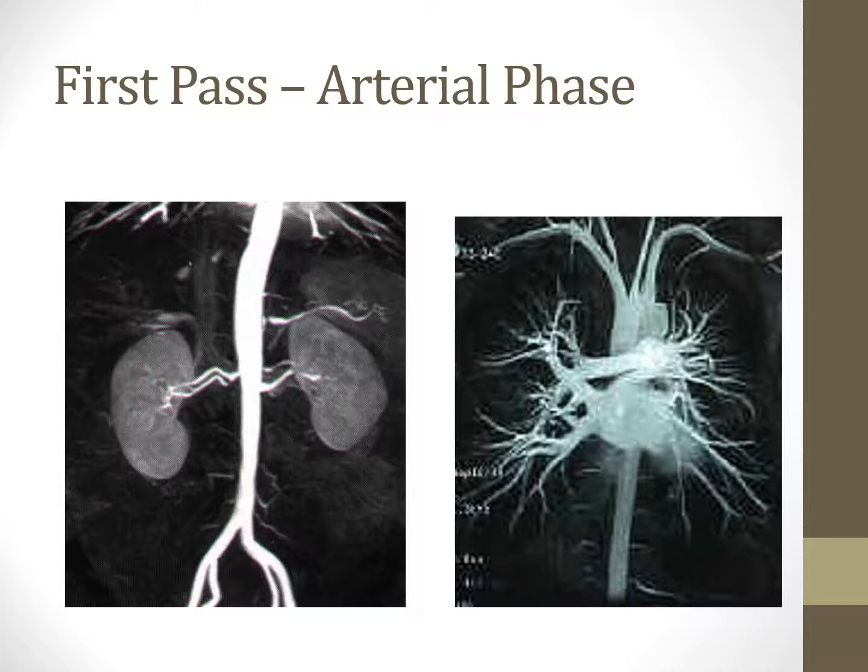The image on the right-hand side of your screen is a pulmonary circulation. Hopefully you recognize that after completion of our cardiac studies that we've talked about. And you can see the pulmonary circulation very well. Now, you'll notice that there are some artifacts in this particular image, and that's very common with gadolinium boluses, as it does change the T1 times of the tissue significantly based on concentration. This is kind of like a ringing artifact that we're getting. It relates not only to the gadolinium concentrations, but also to the timing of the bolus as it goes through the vessels.